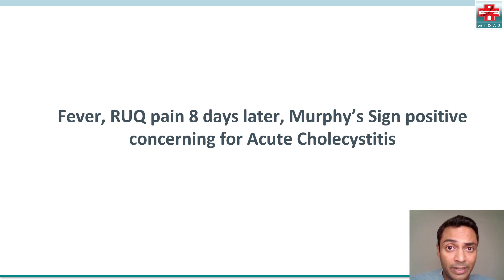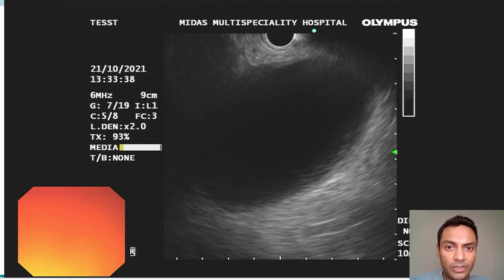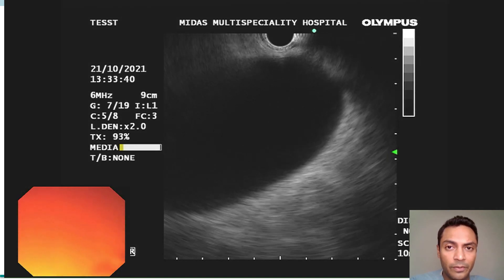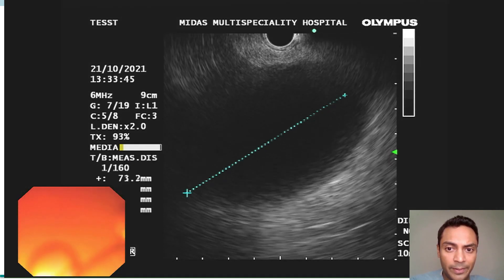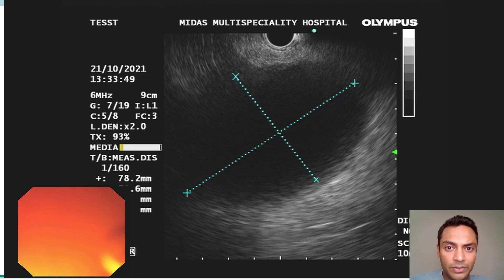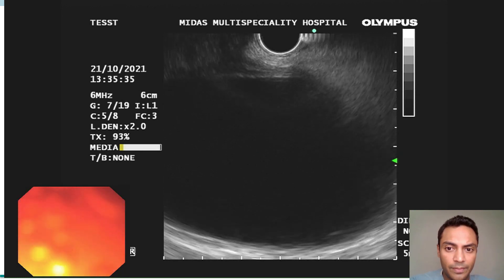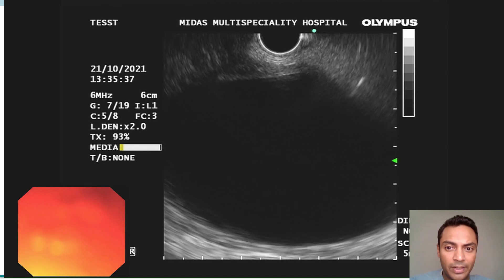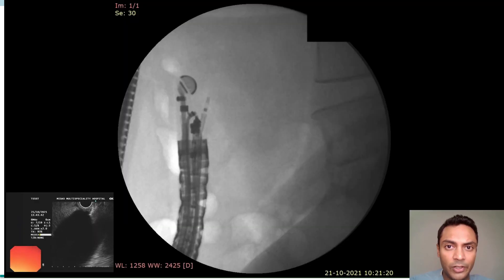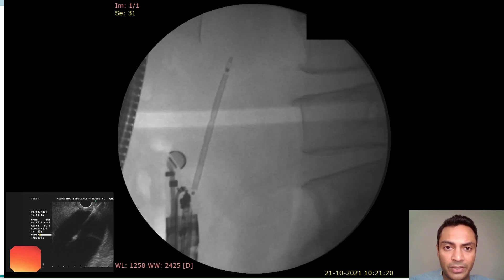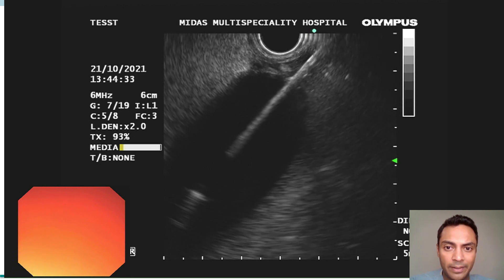She presented with fever and right upper quadrant pain eight days later, with Murphy's sign being positive, concerning for acute cholecystitis. We took her for endosonography and the gallbladder appeared distended. We went ahead with placement of a lumen-apposing metal stent, the Hot AXIOS stent, which is being advanced across the gastric wall into the gallbladder.